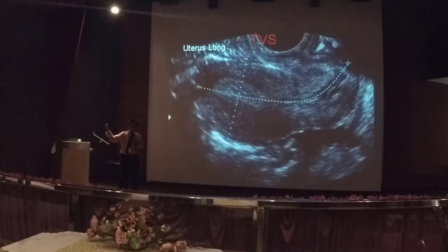So the higher frequency ultrasound wave, the sound wave will travel lagi jauh ke lagi dekat? Wah, fizik. Lagi dekat, kan? So lagi rendah dia punya ultrasound wave, dia travel lagi jauh. So in vaginal ultrasound, the range is between 5 hingga 8 MHz, kan?